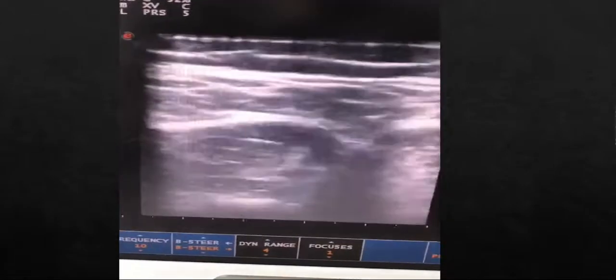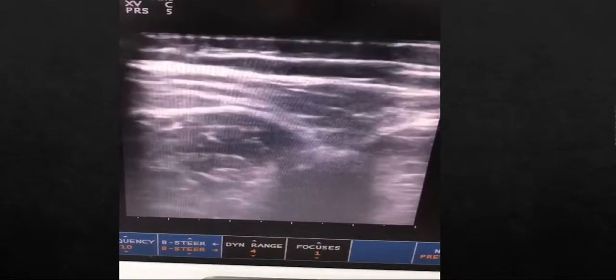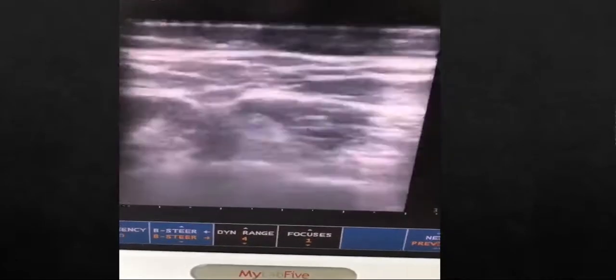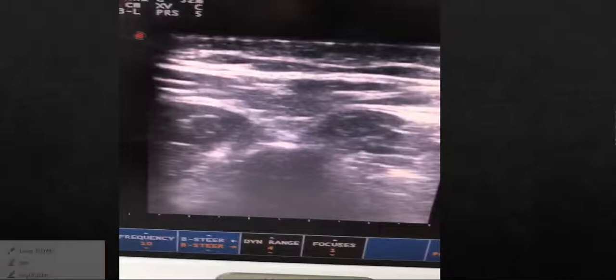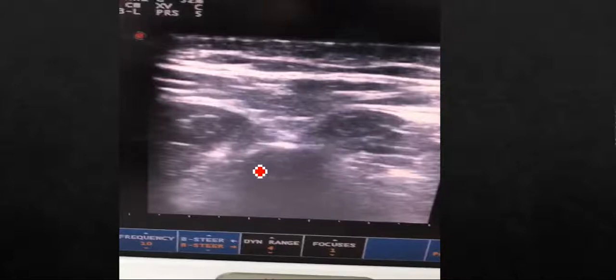This is what you're going to see in your ultrasound machine when you get a transverse view of this point. Basically, this is the spinous process of the patient, these are the paraspinal muscles on the right, paraspinal muscles on the left, and the exiting nerve is going from here on both sides. Now you can visualize the paraspinal muscles very obviously here, and you're going to guide your needle insertion in a 45-degree fashion medially towards the spine.